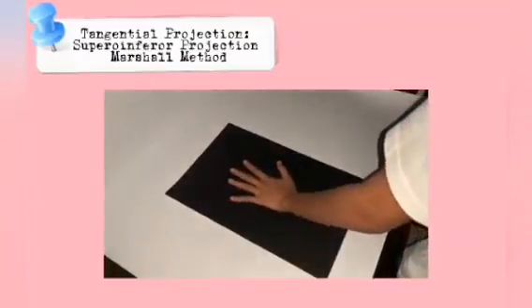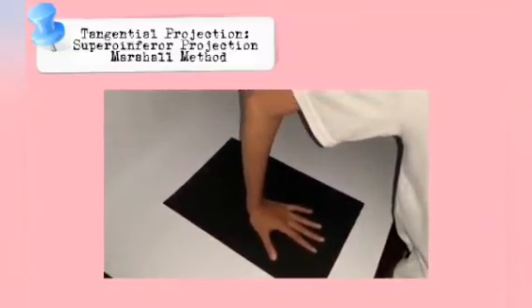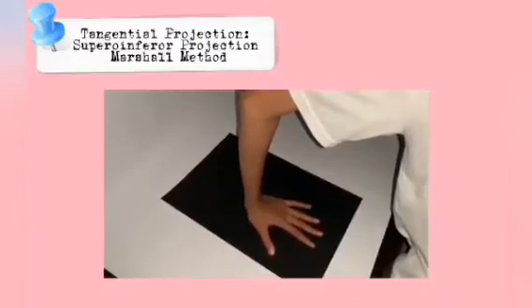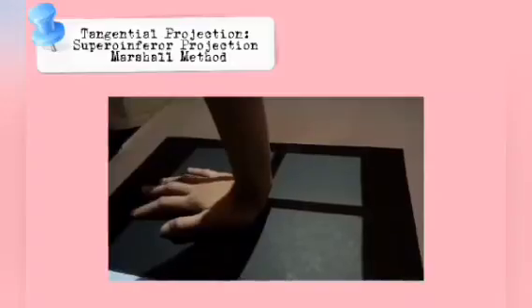Position of part. When dorsiflexion of the wrist is limited, Marshall suggested placing a 45-degree angle sponge under the palmar surface of the hand. This slightly elevates the wrist to place the carpal canal tangent to the central ray. A slight degree of magnification exists because of the increased object to image receptor distance.